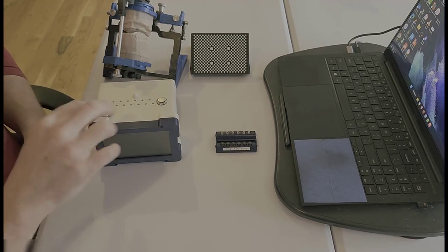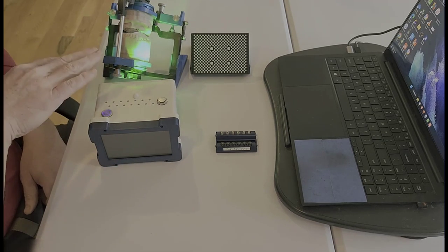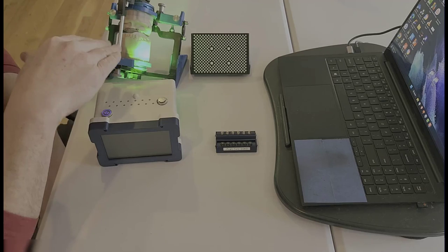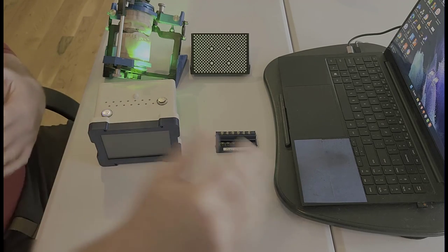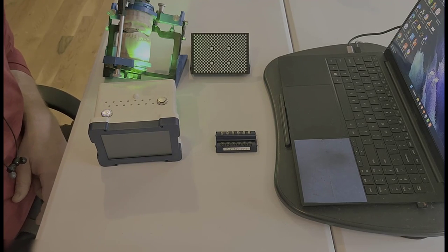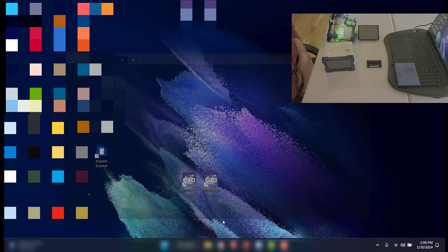So I'm going to go ahead and turn the scanner on. Just one single click on the power button. You'll see these green lights kick on the cameras, but it's got a boot up sequence it's got to go through. It'll probably take about a minute or so. As it's doing that, I'm going to launch the implant scanner software. And here's the icon for it.